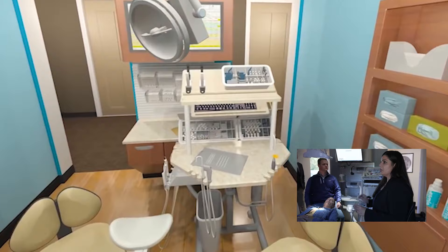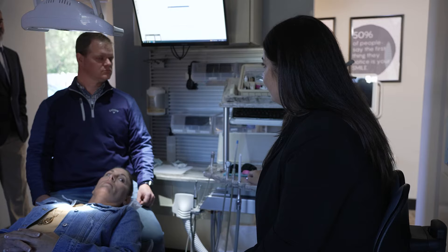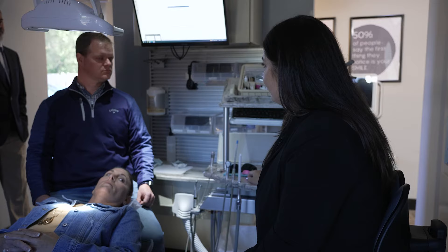Don't worry about whether your setup is 100%. Just worry about the next step, because you've got the bin here to back you up. Anesthetic, topical in place, anesthetic, rinse — I just opened up three minutes to finish my setup.